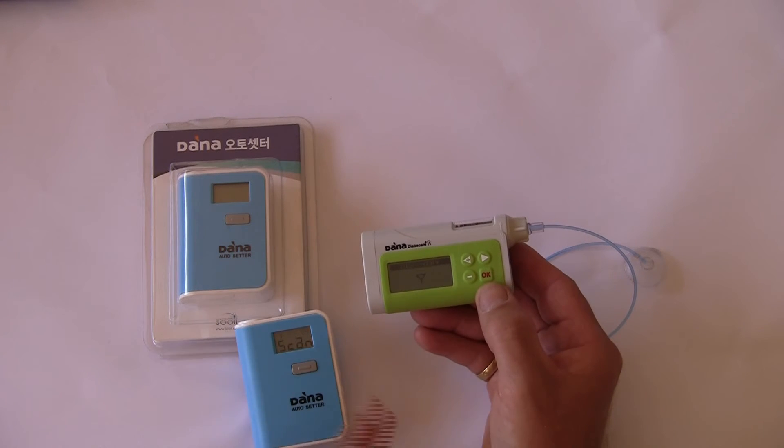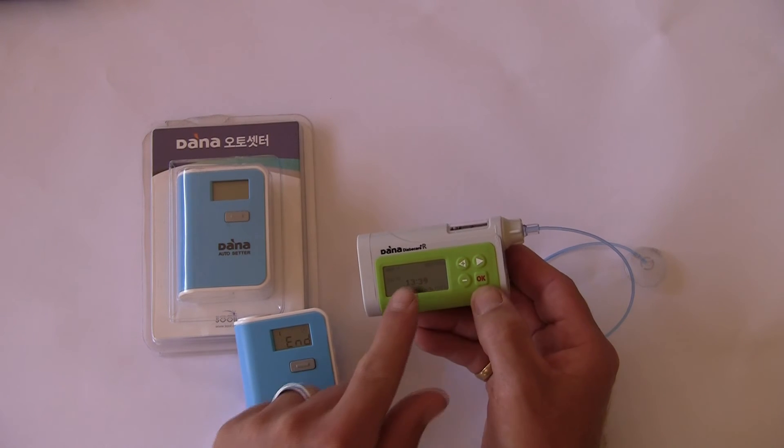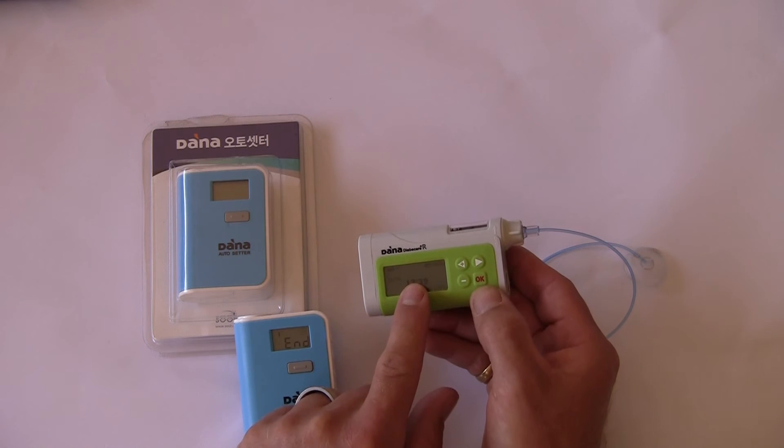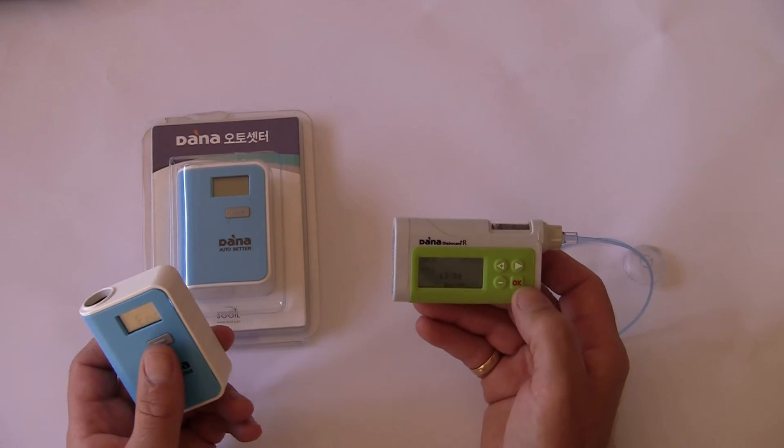The two devices are now communicating via Bluetooth and pairing with one another. It comes up with 'end' on the Autosetter and the main pump menu drops back to the time display. So these two devices now are paired.